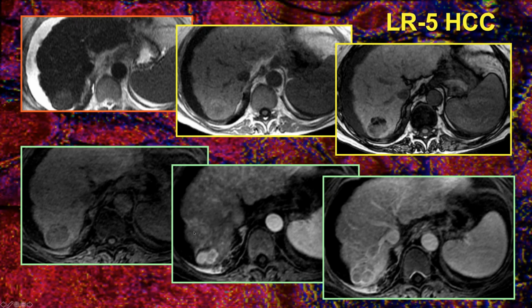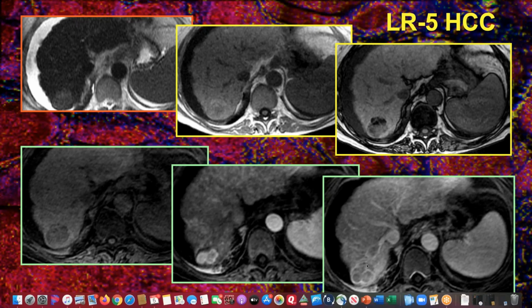The heterogeneous appearance of the liver is such that you can see that there's no sign of hyper enhancement of it. It's not showing up as such on the other images, but it's a good observation. In reading this case, you would need to look at this page up and down and decide it. Can I do another modality to be sure if this is a thrombus or not? Well, you certainly could. Because I have doubts. Yeah, no, I could understand that.